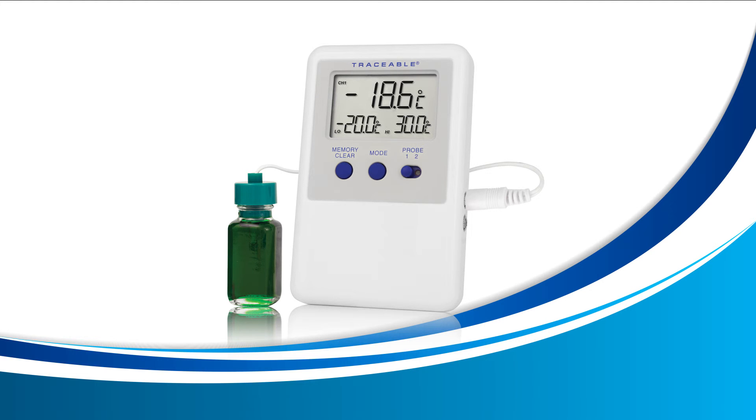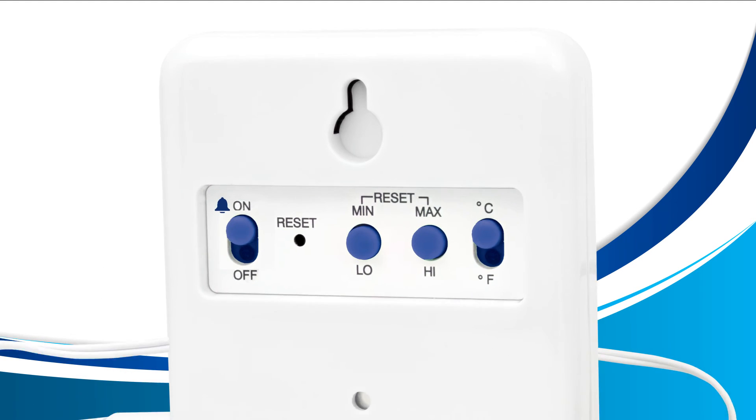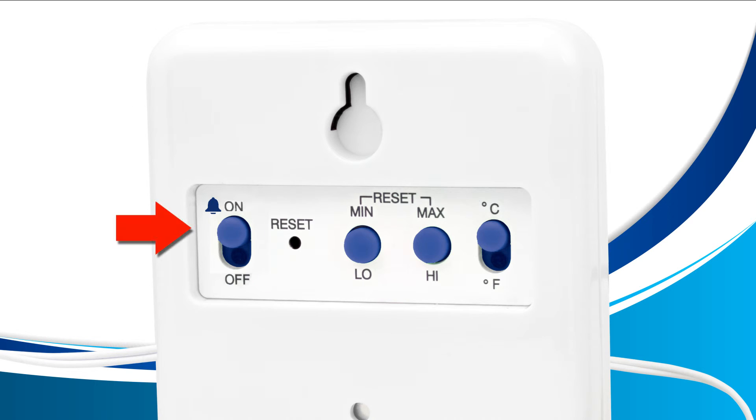Enabling or disabling your alarm. If you prefer not to have your alarm enabled at all, you may do so with the flip of a switch. Turn your unit around and locate the alarm switch to the very left — you'll notice the correct one if it has a small bell beside the switch. Simply move the slider down to turn it off or move the slider up to turn it on.